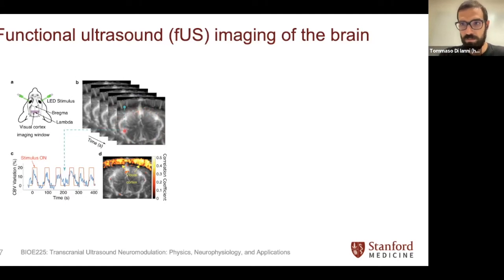And this is the thalamus. So actually up here, we have the superior colliculus, which by the way, is also showing some activation down here. So the superior colliculus is a part of the thalamus that is relaying visual information to the visual cortex, and it's also getting activated down here. And then the other parts are other subcortical regions that I cannot remember, and maybe Keith, you're more familiar with that as you're more of a neuroscientist.